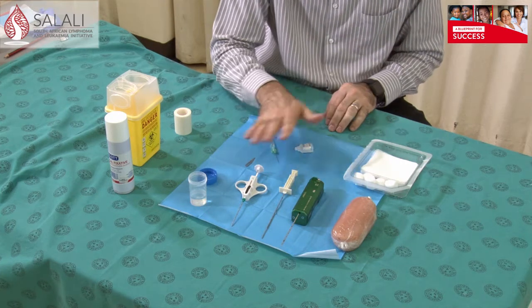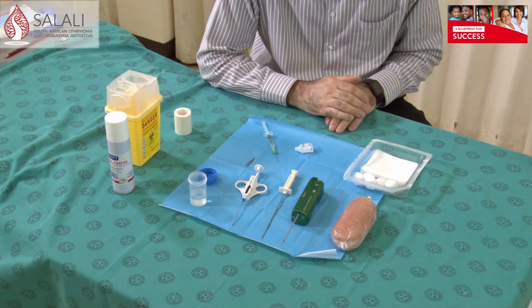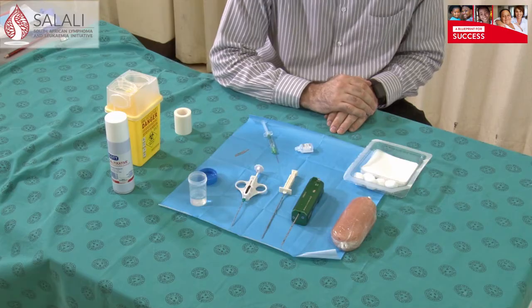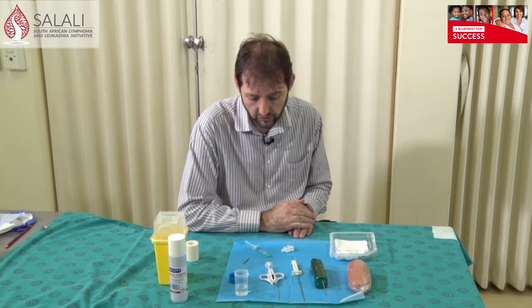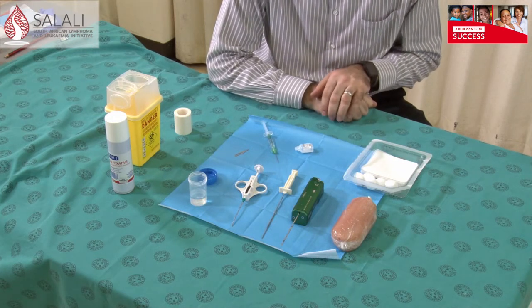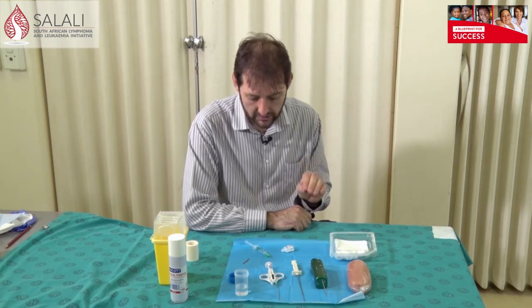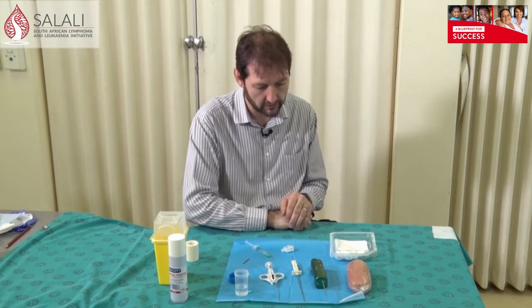In my clinics it will always be automatic needles, but use what you are familiar with. You're going to need some formalin to put your tissue specimens in. You're going to need a surgical blade — the best one I would suggest is an 11 blade, it has a nice sharp tip for making a stabbing incision through the skin. We've got some lignocaine — it's essential that you put some local anesthetic in. I would suggest you don't inject the tumor itself; there are no pain receptors in tumors. Inject the skin and the subcutaneous tissue you're going to enter through on your way to the lesion.